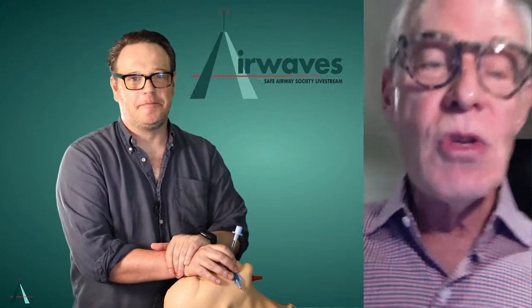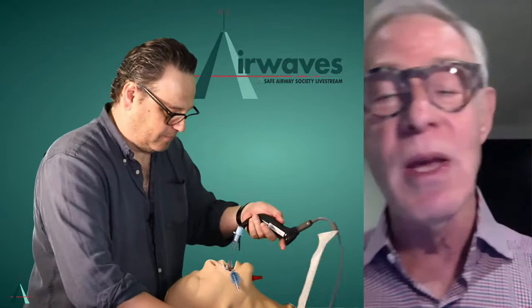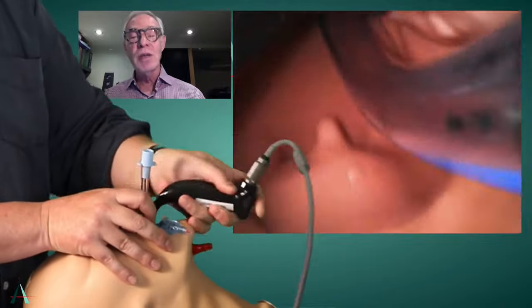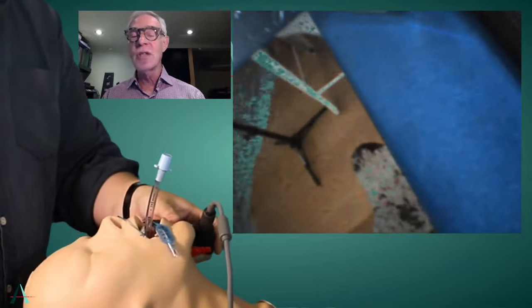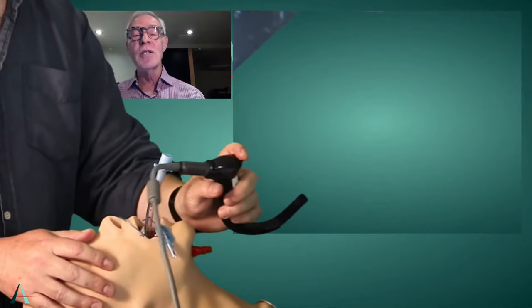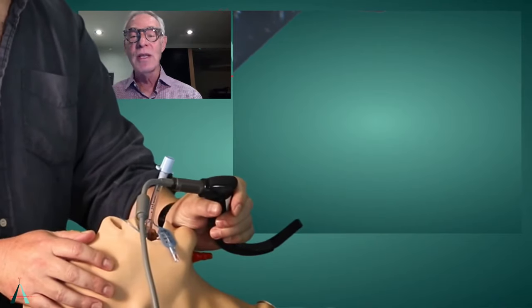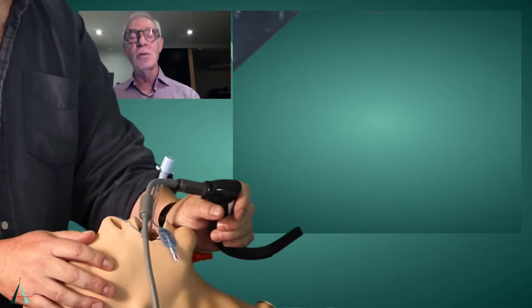Let's go nasogastric. Okay, so just run us through what we're trying to achieve here, Richard. All right. So the endotracheal tube is already in situ. Your surgeon says the stomach is getting in my way, I need it decompressed. You've put your fingers in the mouth and you're trying to advance a nasogastric tube, and you're unsuccessful. Meanwhile, you've got these deep indentations in your index and middle finger from encountering the teeth underneath the drapes.